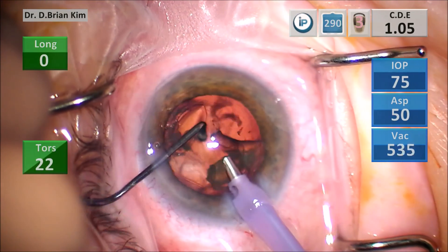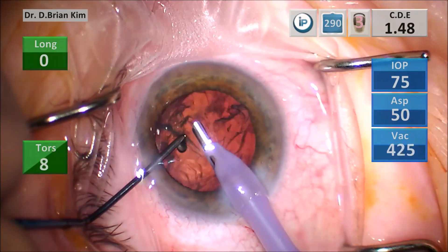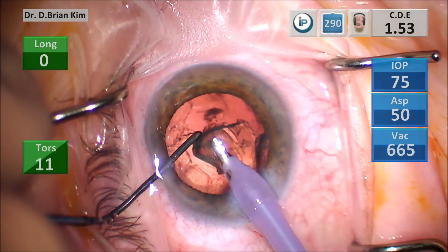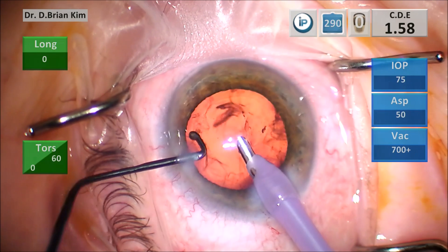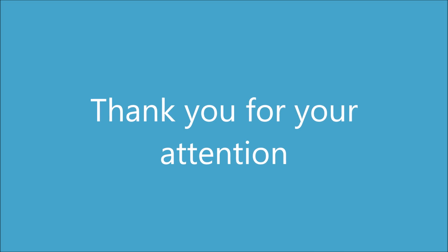The pronation and supination move to harness the lens at the level of the equator, bringing the chopper centrally to meet the phaco tip in the middle and fracturing purely mechanically — without any energy or vacuum — is my fundamental technique. The only variation is on the initial step when you have to place that phaco tip sub-incisionally. I hope this was helpful to you; thank you for your attention.